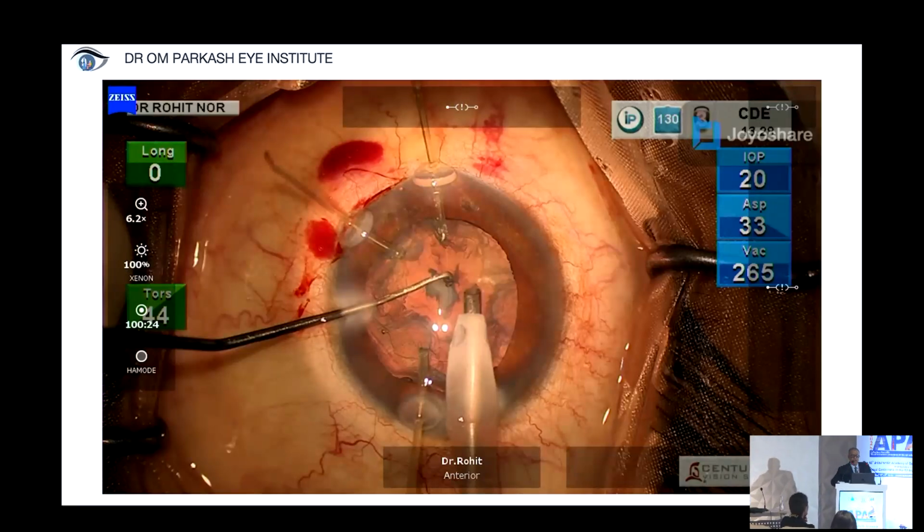David Chang showed the spiral CTR. I think when he comes, he'll show it, and it's wonderful, but it's not that easy to use. I prefer the standard plain injector. Much more difficult. And what do you do?